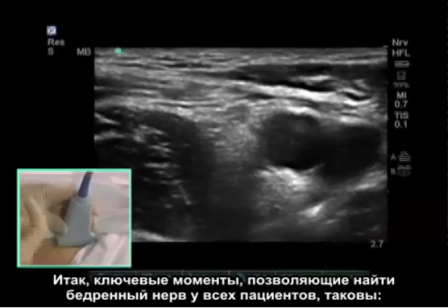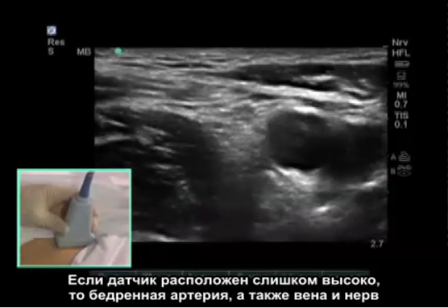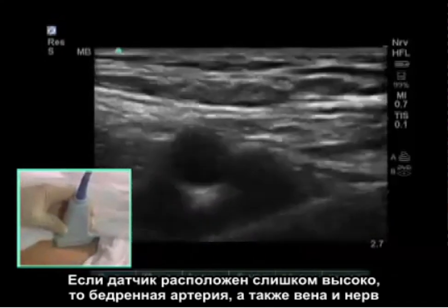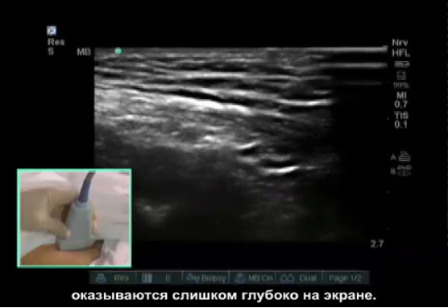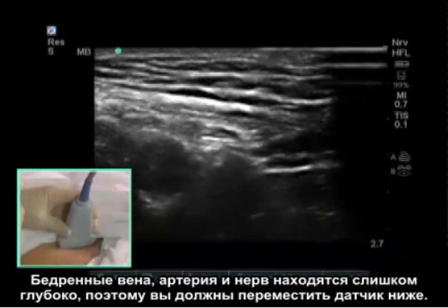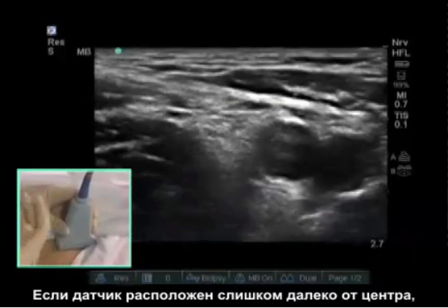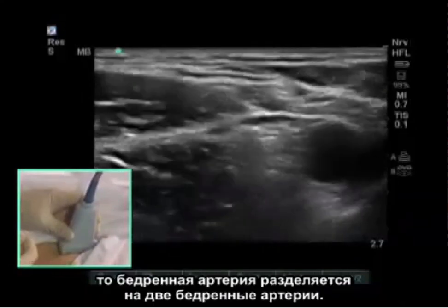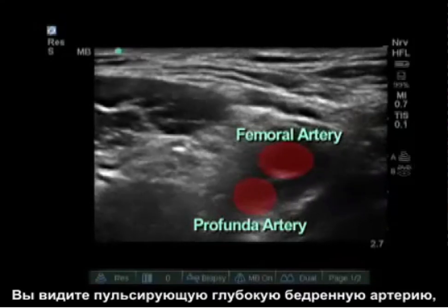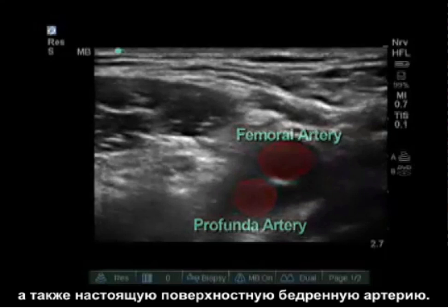Some keys to find the femoral nerve in every patient are as follows. If the probe is placed too cranially, your femoral artery, vein, and nerve drop deep on the screen — they are too deep, so you need to move the probe caudally. If your probe is placed too distally, that femoral artery is going to split into two femoral arteries. You can see a profunda femoral artery deep, as well as a true femoral artery superficial.